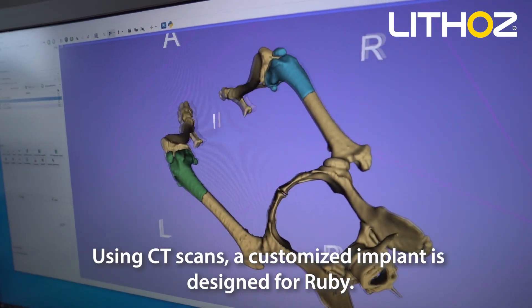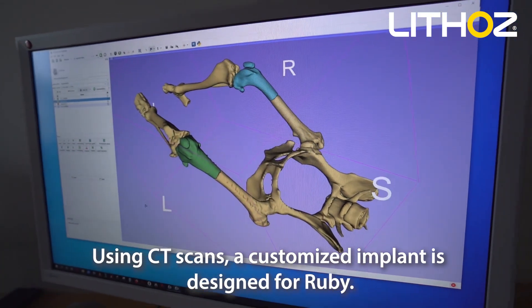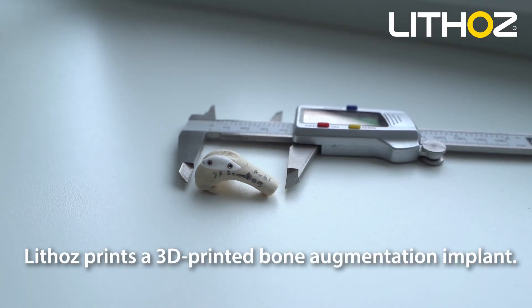Using CT scans, a customized implant is designed for Ruby. Lithos prints a 3D printed bone augmentation implant.